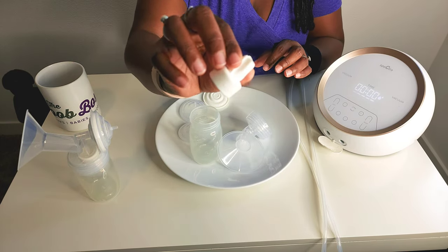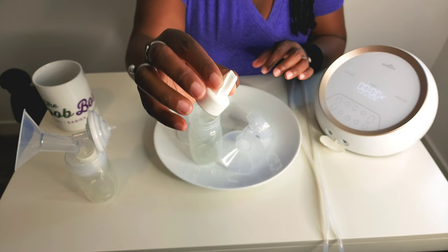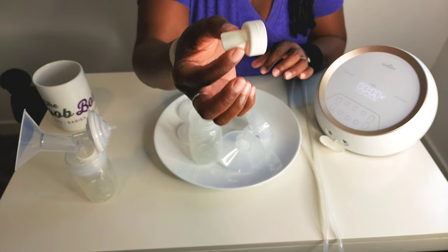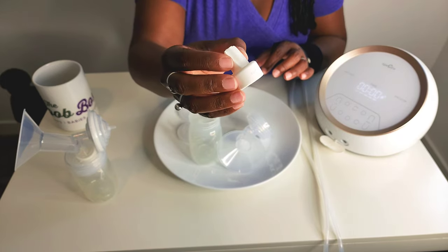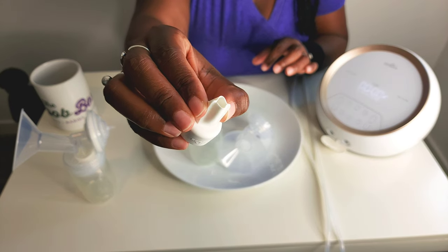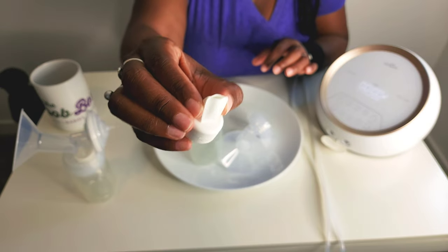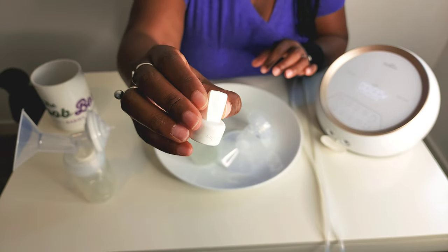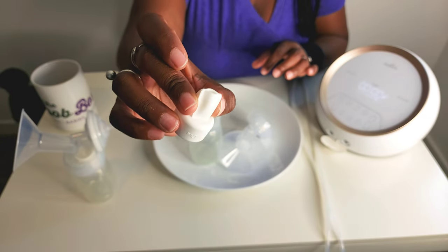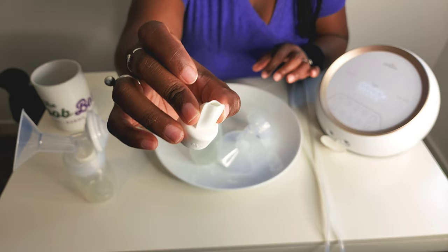This is probably one of the most important pieces, and one of the things that most people forget when they come in for a lactation consult in the Perfect Wish Clinic. This is what we call the duckbill. This is what's going to allow you to create a good vacuum. It has a slit right at the bottom of the opening. You want to always check these before you put them on your pump, to make sure the slit hasn't extended past what it came with, or doesn't have a little tear, because if it does, you're not going to get maximum suction.